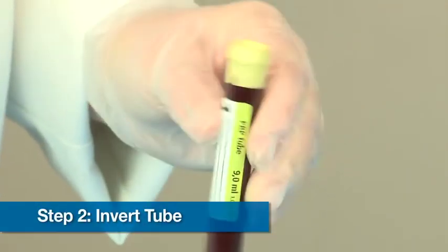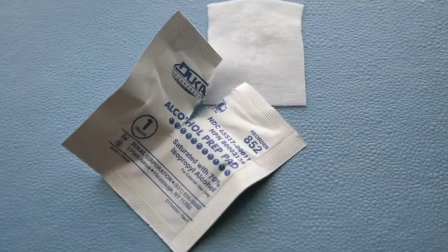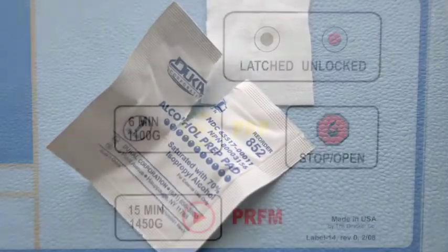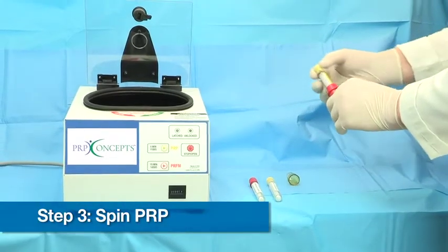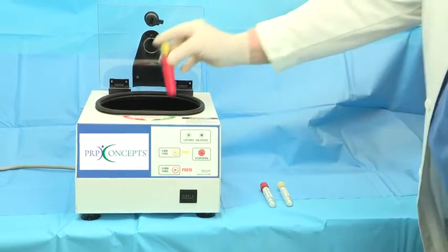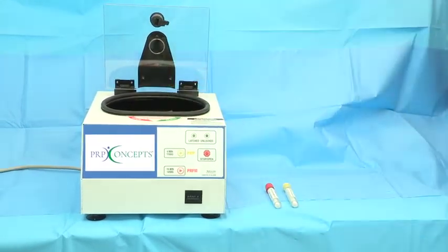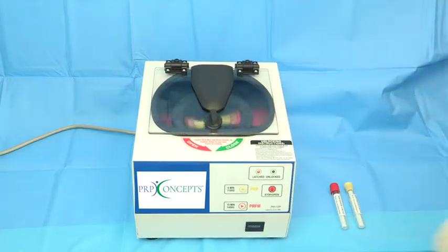Invert tube 7 times to mix anticoagulant with patient blood. Wipe tops with clean alcohol swab. Turn on centrifuge and unlock lid. Place yellow PRP tubes into individual tube holders, placing cap on top, and into centrifuge. Lock the lid. Spin for 6 minutes at 1100 RCF.